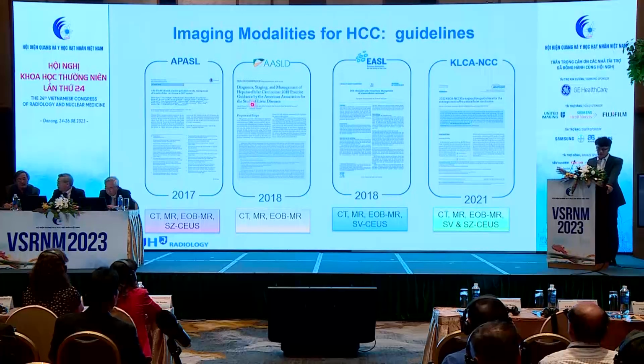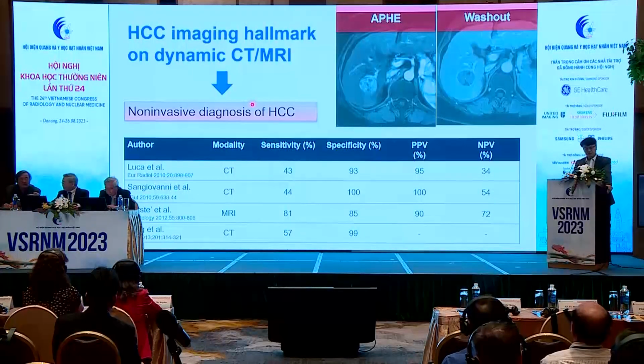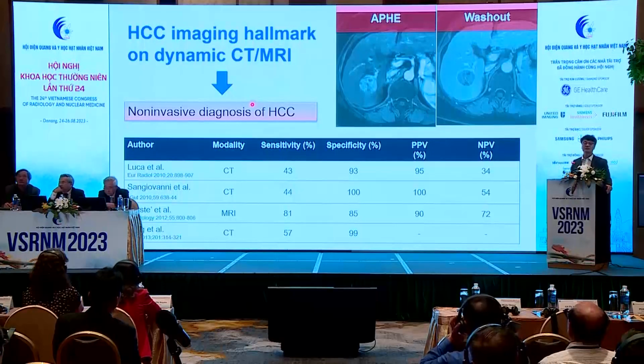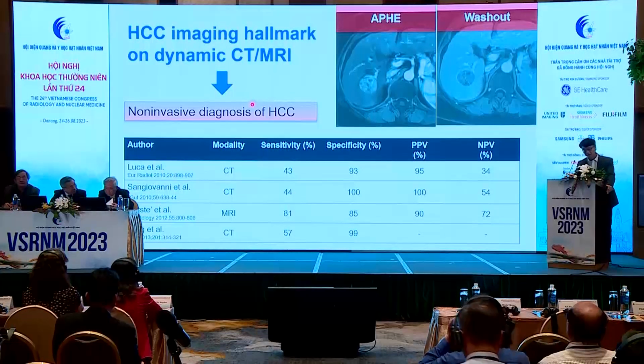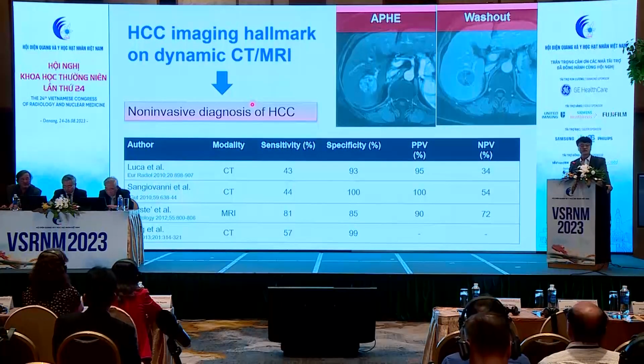So as you can see here, all the major guidelines include EOB-MRI. Here you can see the typical imaging features of HCC. Once you can see a nodule showing arterial phase hyperenhancement and also washout on CT or dynamic MRI, you can make a definitive diagnosis of HCC without biopsy.